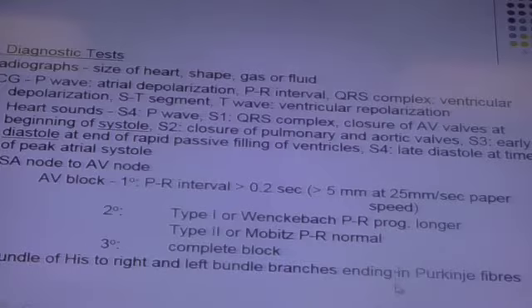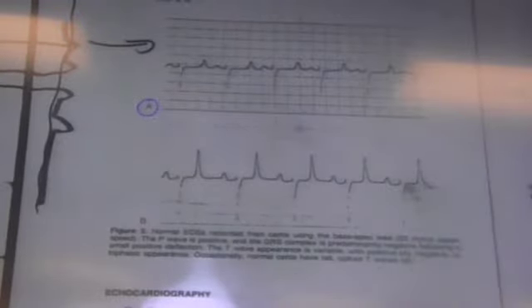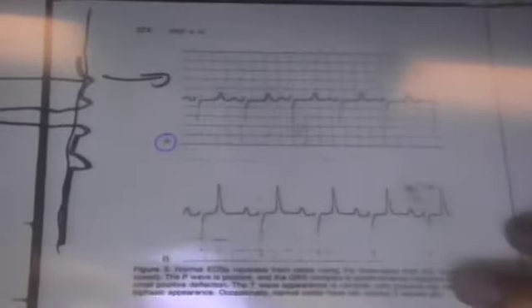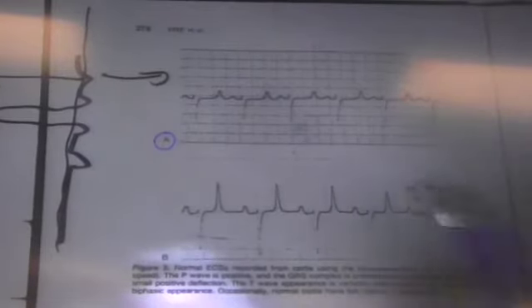So a couple take homes with the electrocardiogram in animals. As far as your normal appearance of the electrocardiogram in general, there are a couple things to be aware of. The one I've circled here is the one that we typically use. We typically go to number 2. So this is on the base apex lead, and you turn it down to lead 2, Roman numeral 2. So this is what we look at.